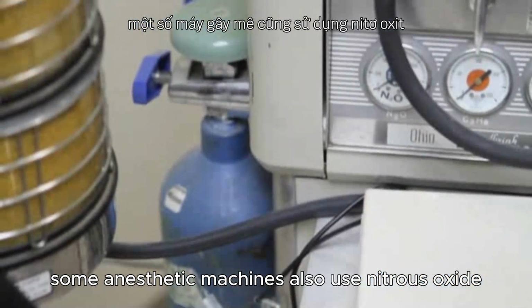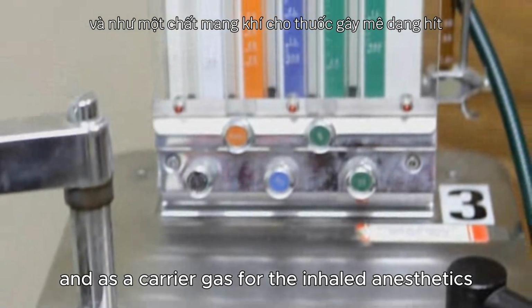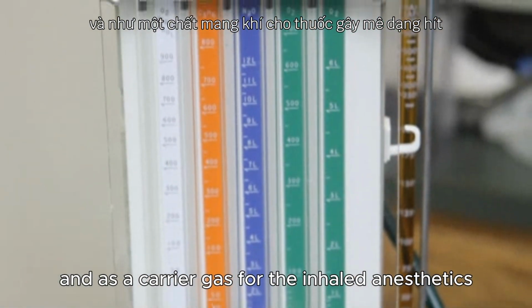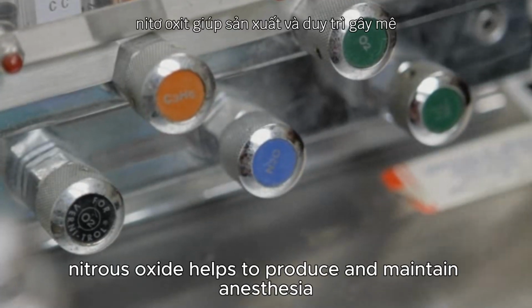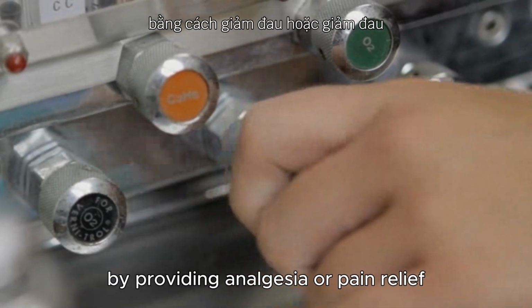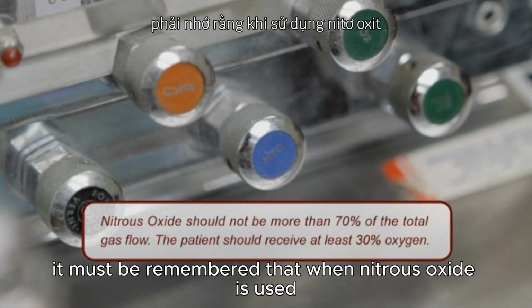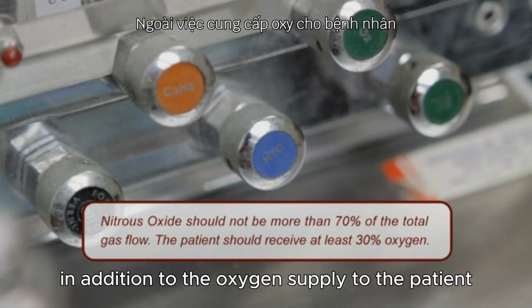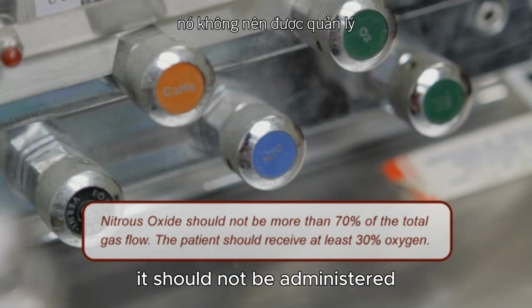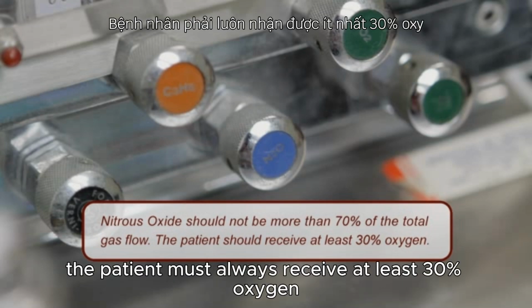Some anesthetic machines also use nitrous oxide for added analgesia and as a carrier gas for the inhaled anesthetics. Nitrous oxide helps to produce and maintain anesthesia by providing analgesia or pain relief. It must be remembered that when nitrous oxide is used in addition to the oxygen supplied to the patient, it should not be administered at greater than 70% of the total gas flow. The patient must always receive at least 30% oxygen.